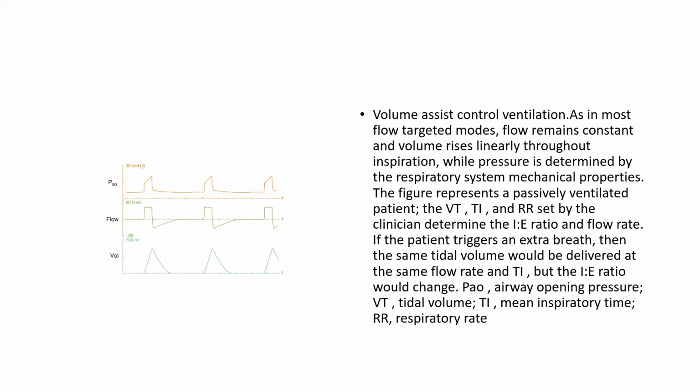The figure represents the passively ventilated patient, and the tidal volume, inspiratory time, and respiratory rate set by the clinician determine the inspiratory-expiratory ratio and the flow rate. If the patient triggers an extra breath, the same tidal volume would be delivered at the same flow rate and inspiratory time, but the I:E ratio would change.